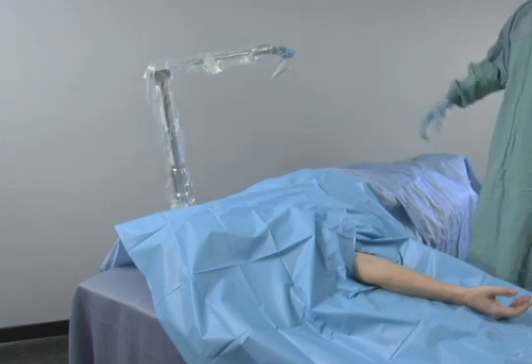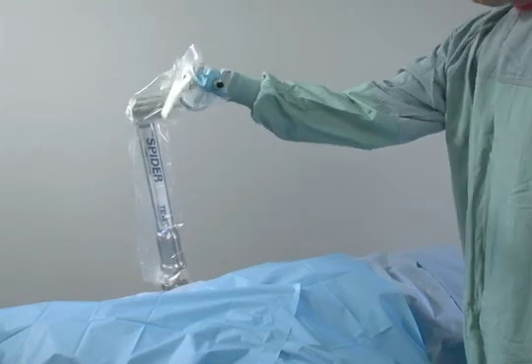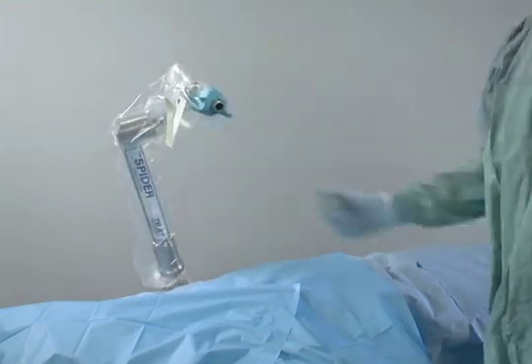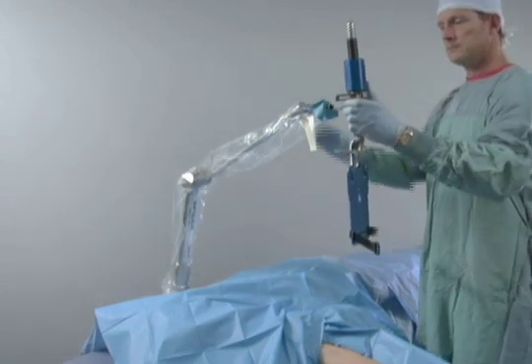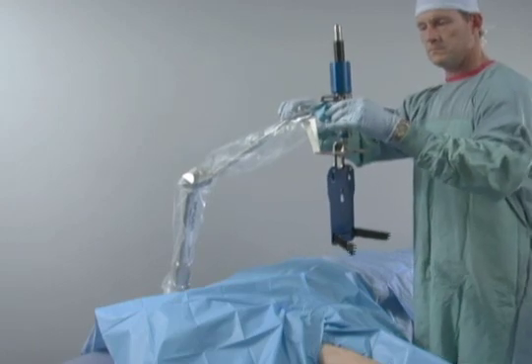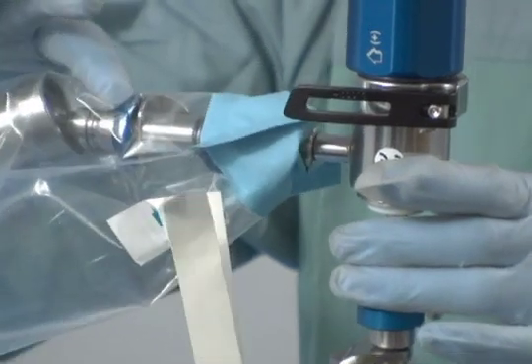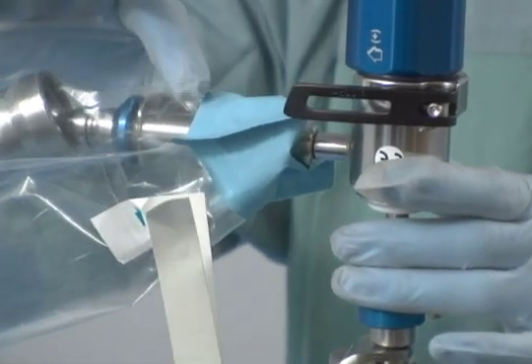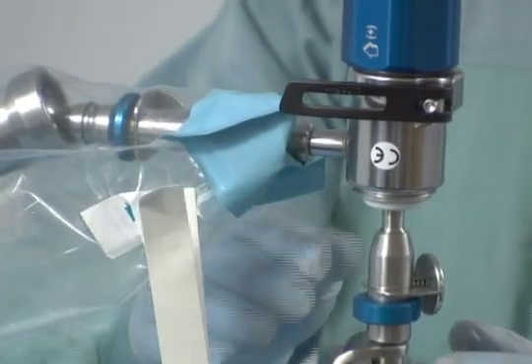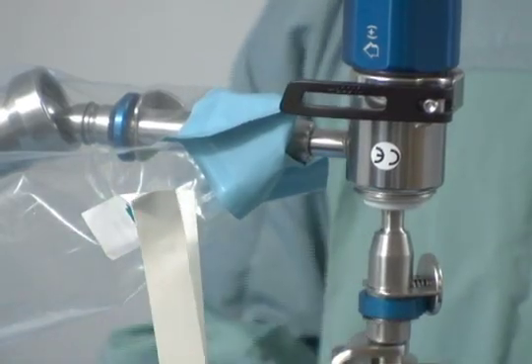The spider is grasped by the slender arm and moved so the terminal end is over the patient's elbow and as high as possible. The traction and wrist arthroscopy accessory are inserted into the female quick connect. Pull out on the traction accessory to ensure that it is connected properly. Each of the quick connect locks are then engaged behind the release buttons, including the sliding locks on the spider and piggyback, as well as the rotational lock on the traction accessory.